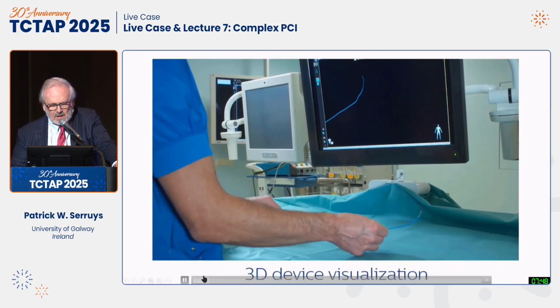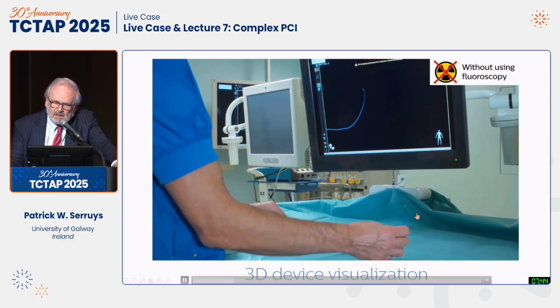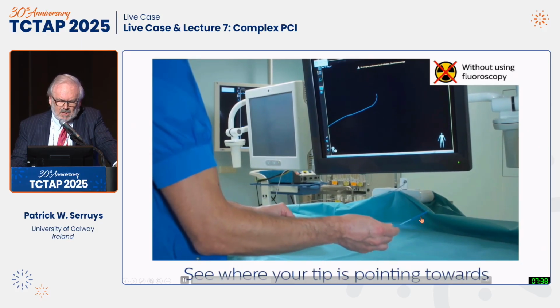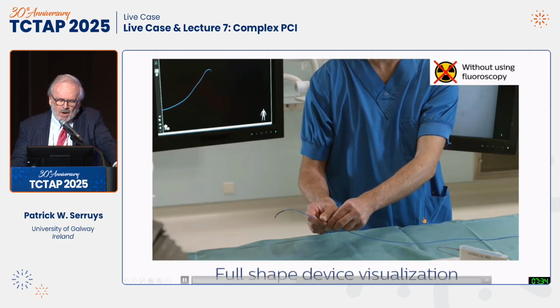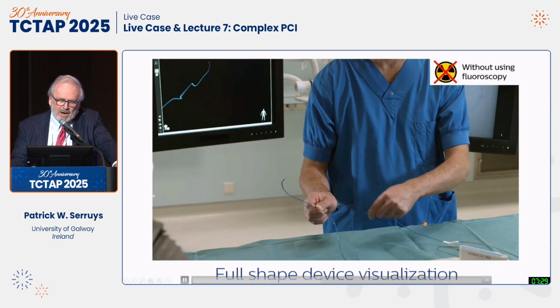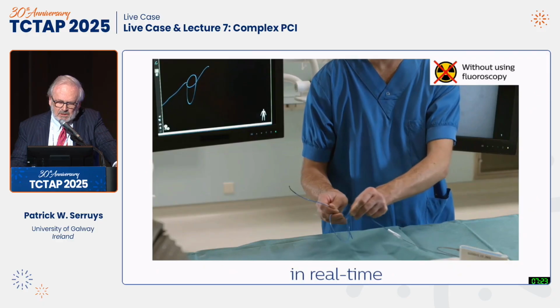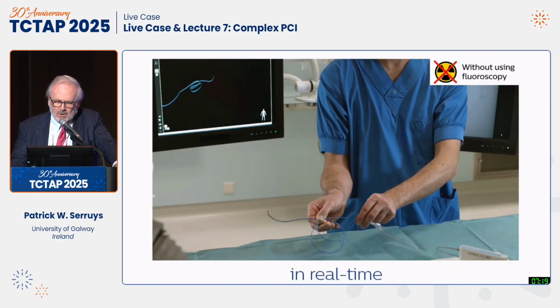So you have seen that. I will push a little bit forward. But you see the bending, and then I will show you the overlay that you can do on the multi-slice CT scan, or you can do on the fluoroscopy. Once again, the loop down in the catheter, all that because you handle the microfiber in the catheter or in the guide wire, and instantaneously you have the motion, the three-dimensional reconstruction of the guide wire.